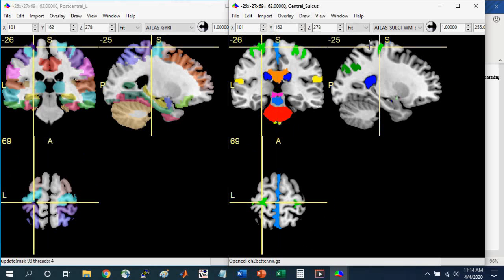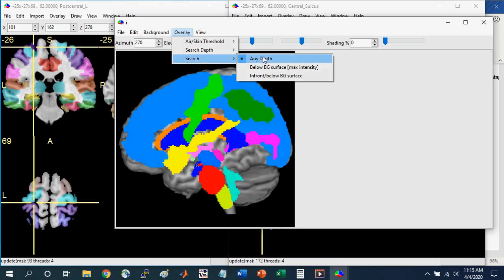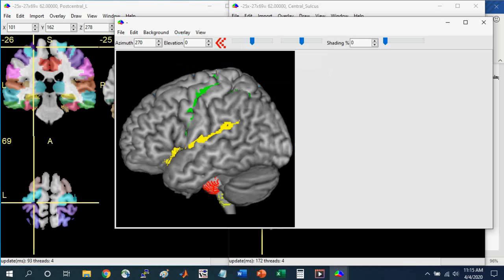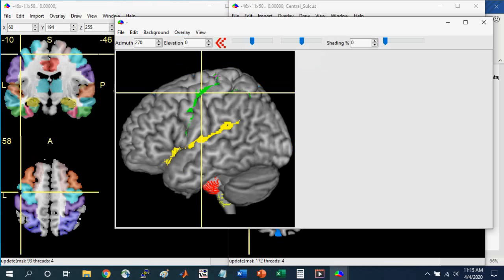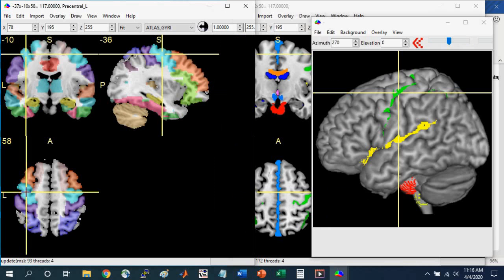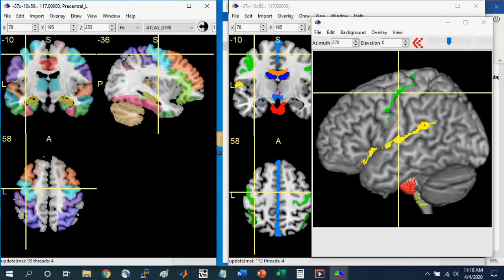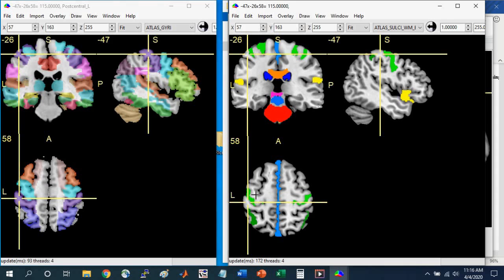Here in green is the central sulcus. To highlight the usefulness of having these two atlases open. And so I can go to Window, Render. So I'm going to go to Overlay, Search, and select Below the Surface. So it's only showing me regions that are 16 millimeters deep in the brain. And you can see the central sulcus dividing this gyrus here and this gyrus here. And if we look in the gyrus atlas, we can see the labels associated with these two different gyri. So in teal, you can see the precentral gyrus. And in purple, you can see the postcentral gyrus. So this is a way to use both atlases at the same time to learn these different brain structures and how they relate to each other.